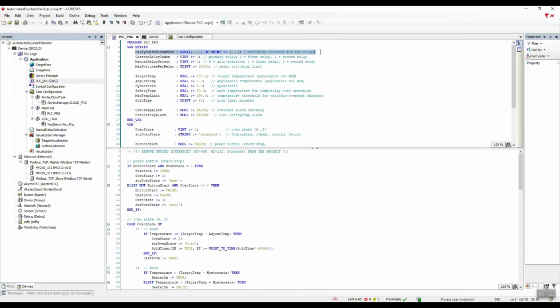The current number of switchings for each relay. We'll use the main relay and a backup relay. The type of relay being used. A value of 0 corresponds to the first relay, the main one. A value of 1 corresponds to the second relay, the backup.